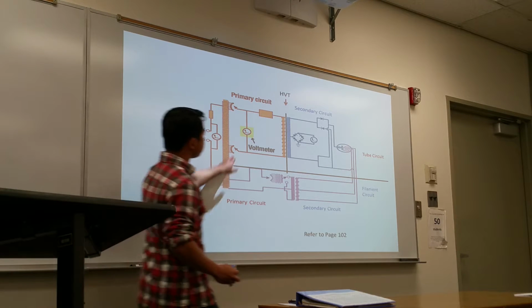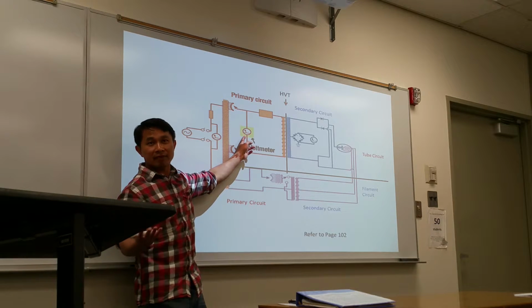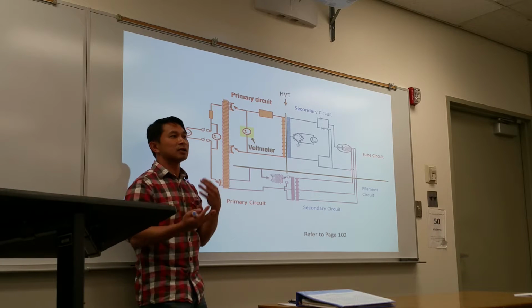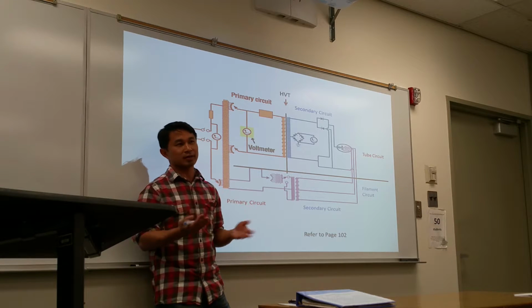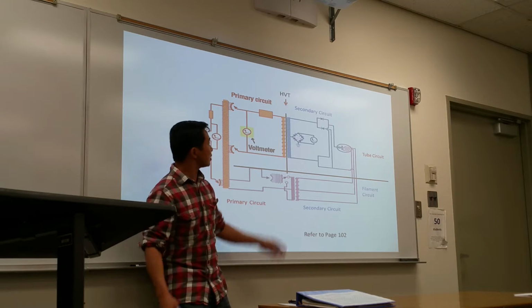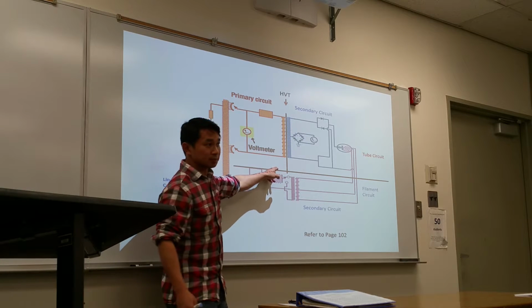This is the diagram. So we have a voltmeter here. Sometimes we also refer to it as a pre-kV meter because on the primary side it's low voltage. So everything is only coming as volts. As it comes to the other side, it becomes kV. But we'll call it a kV meter because the end result is kV coming out. So it's located on the primary side of the high voltage transformer.